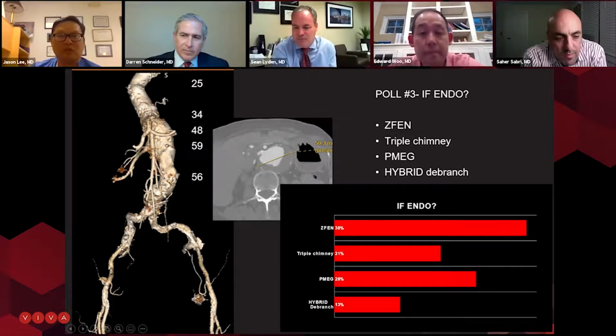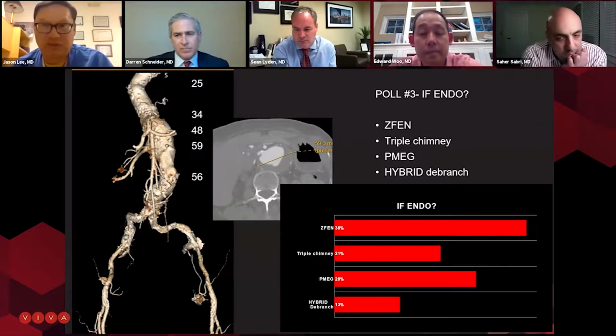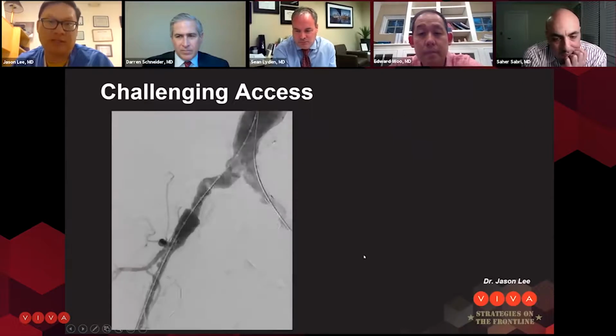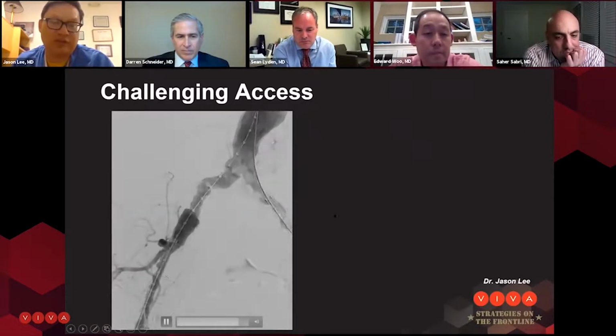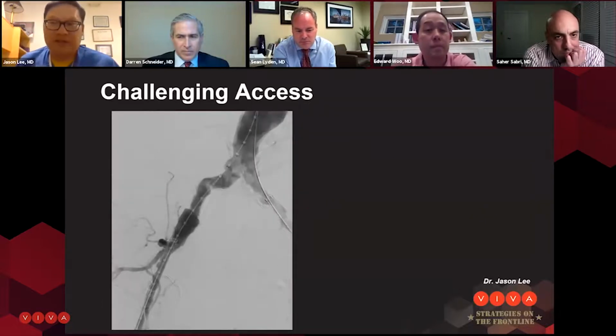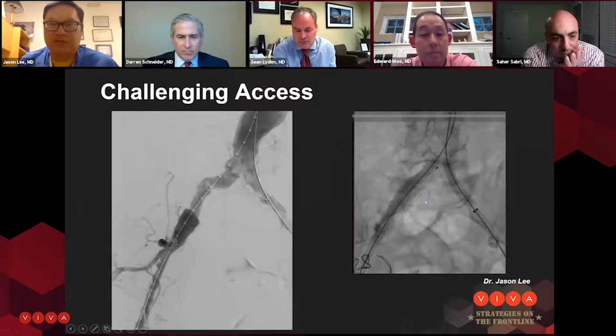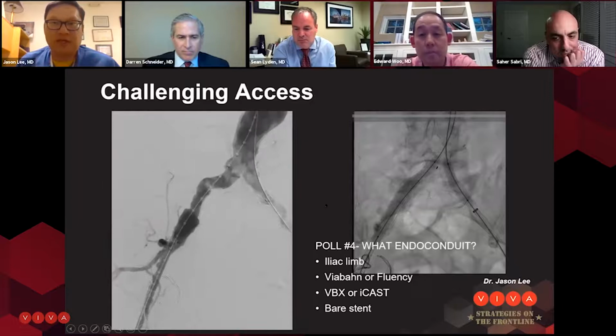Yeah. So we've had a pretty good experience actually combining some things, and this has been on my quest, having had reasonable experience with all of these techniques, to try to combine techniques. So there was some challenging access, as you imagined. The plan was to do the renal with a fenestration, and then to do a parallel graft for the SMA. With the challenging access, we wound up putting an endoconduit here because I couldn't even deliver the 18 French sheath through this.